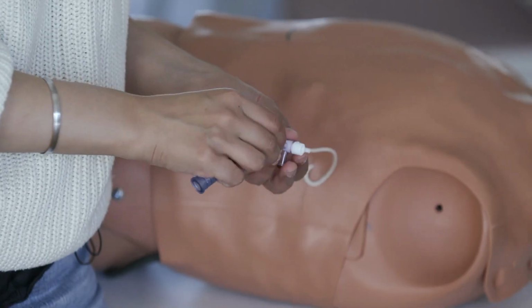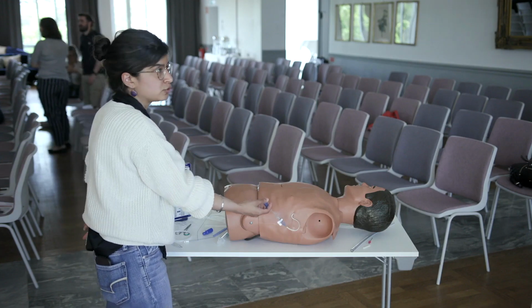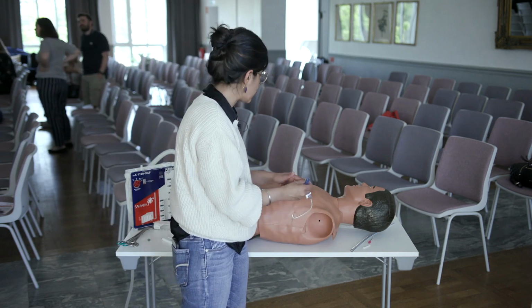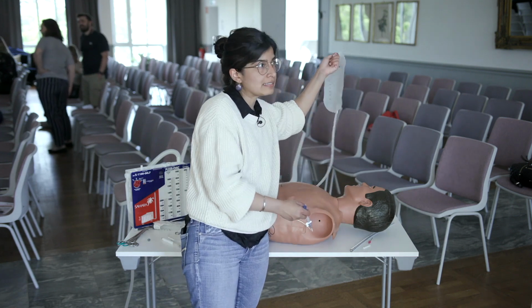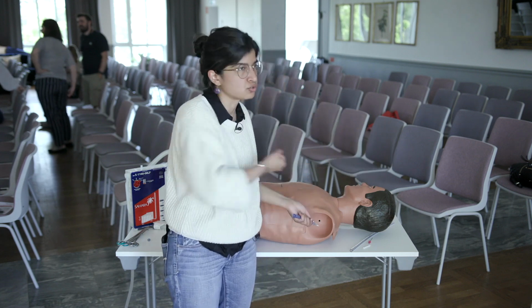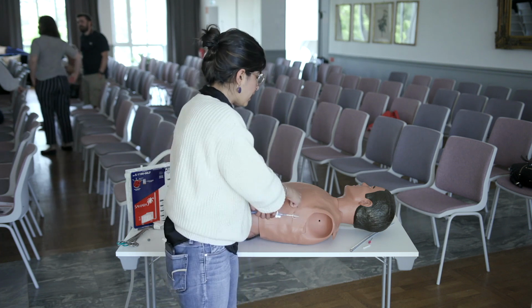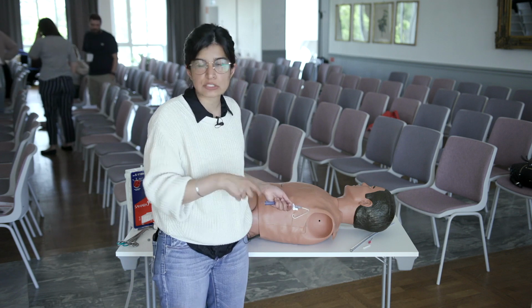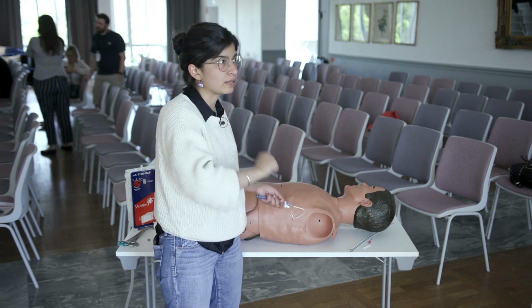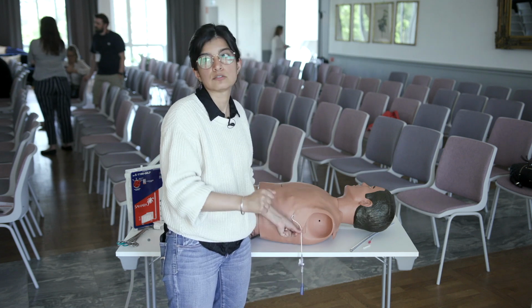Then you've got this little handy dandy thing on the other side, and this piece goes to the end of the drain, the pleura bag, I mean. And then you can take off samples. You can attach this to a bag like this, let it drain by gravity. Or you can take a 60 cc syringe and just draw an effusion out if you're doing it for diagnostic reasons. Okay, and then I secure my drain in the same way as a chest tube, so an air knot on the side and then wrap it around the drain, tie it on the drain. Just be mindful that you don't tie it too tight, otherwise the drain's going to be compromised.